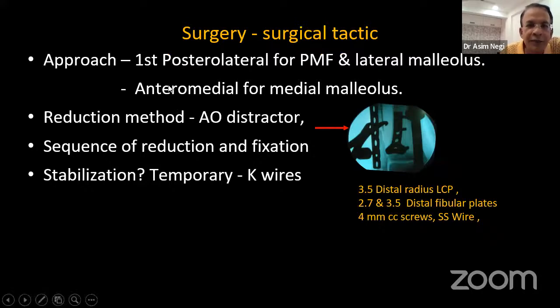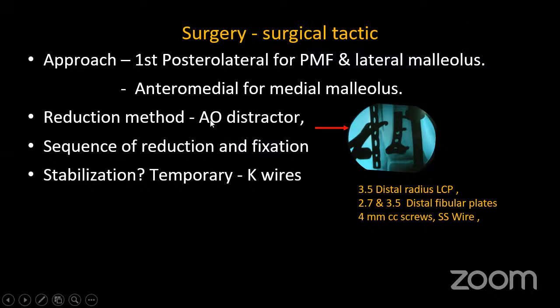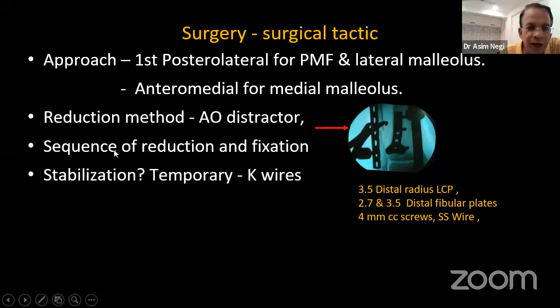First, I take a posterolateral approach and fix the posterior malleolus and the lateral malleolus, and then I turn the patient supine after closing the posterior wound and go to the medial malleolus by an anteromedial approach. You may require an AO distractor if it's an old injury, not this particular patient, it was some other patient. We will see the sequence of reduction and how I achieve the fixation.